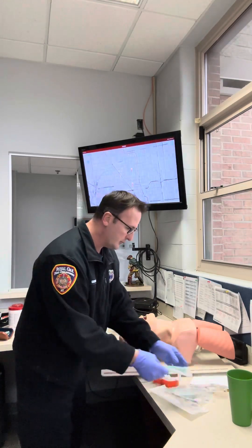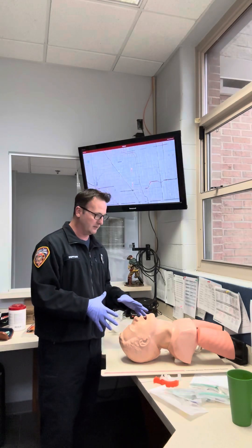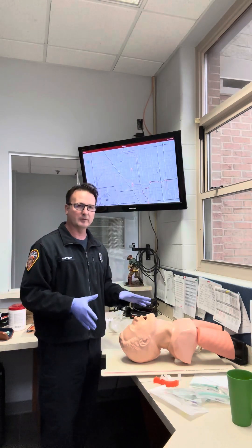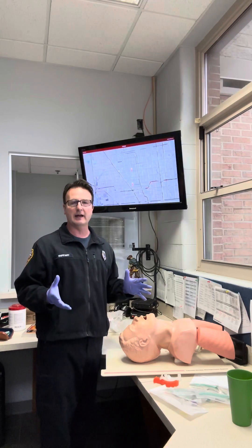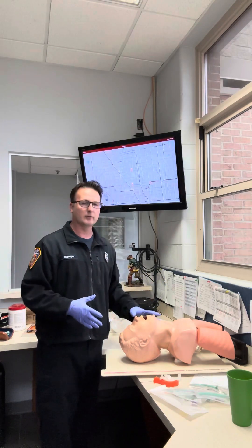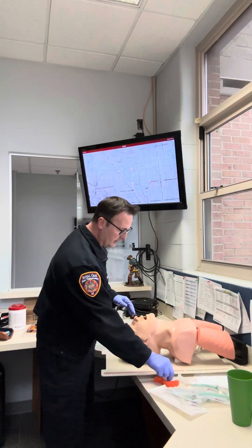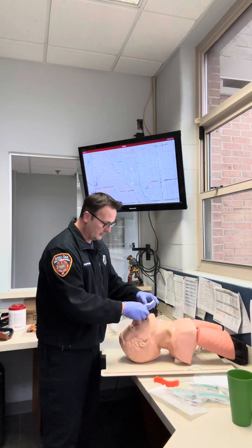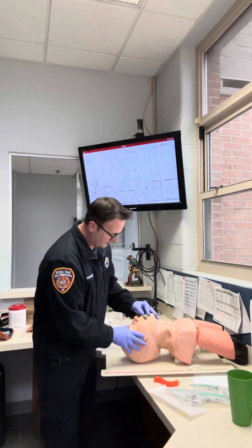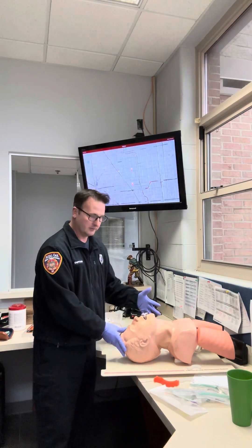For today's example of rescue breathing, after we assess this patient and determine that he's unconscious — there are agonal respirations, no respirations, or he's apneic — we're going to start rescue breathing. We're going to go with an oral airway and insert it after performing the head tilt-chin lift.